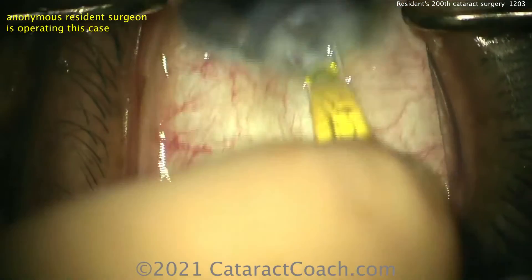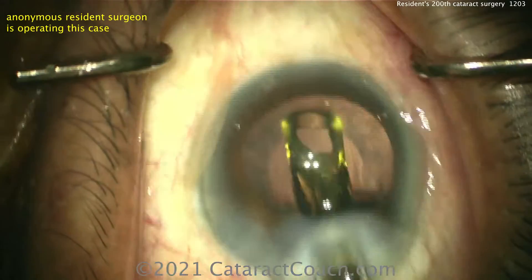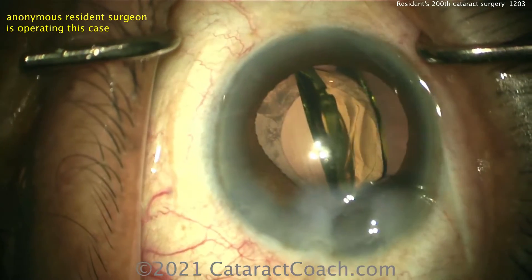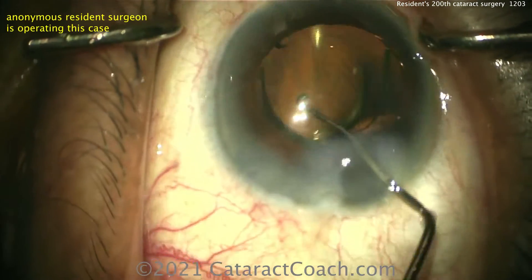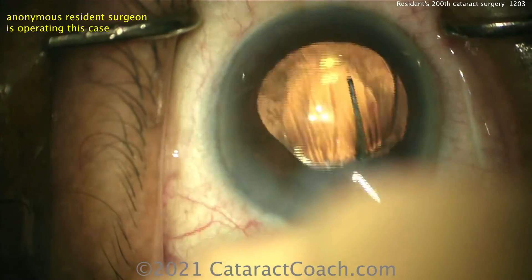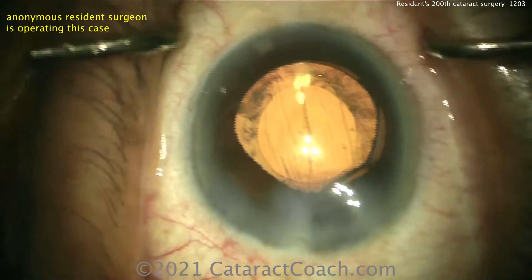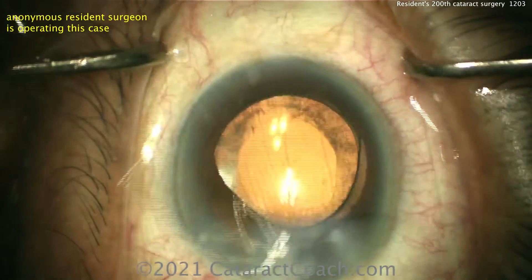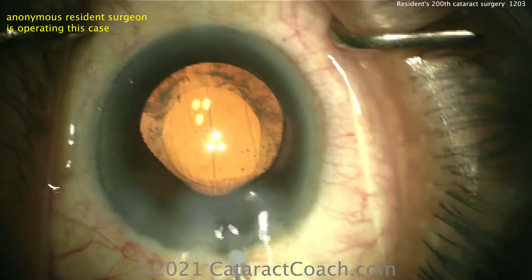Here comes the lens — and this is not ideal, no, no, no. Use the second hand, get some counter-traction, counter-fixation. I'd rather you enlarge the incision. Remember, if anyone tells you the cornea will stretch, it's not stretching — you're ripping it. And now you can see it's a baby rhexis — somewhere between four to four and a half millimeters in diameter, and that makes the surgery far more challenging.